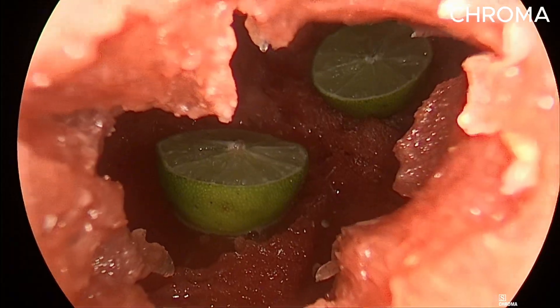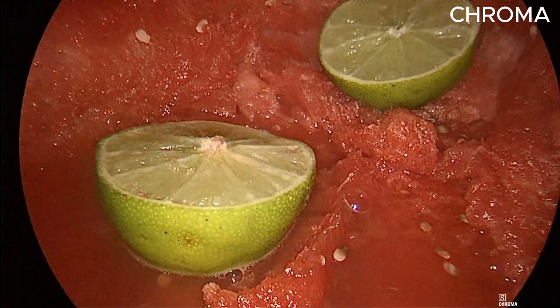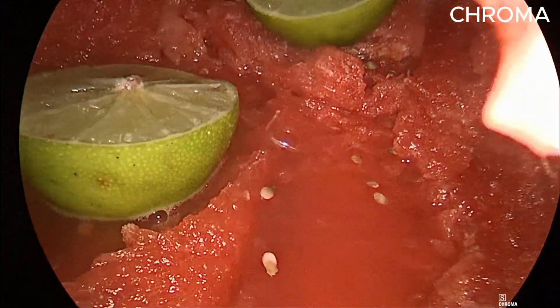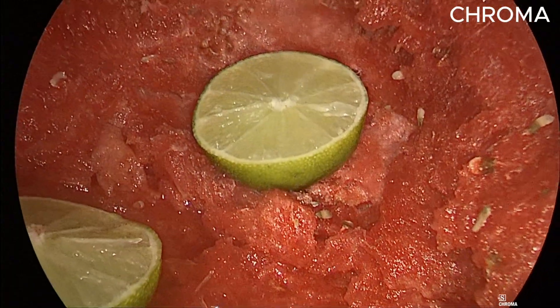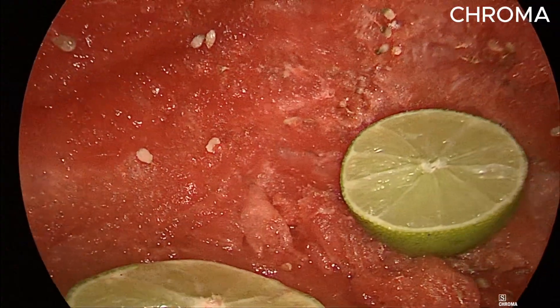Chroma is intended to increase color contrast. This mode improves the perception of fine structures via contrast enhancement, particularly in the red area. The original colors are retained, but the color intensity has changed.